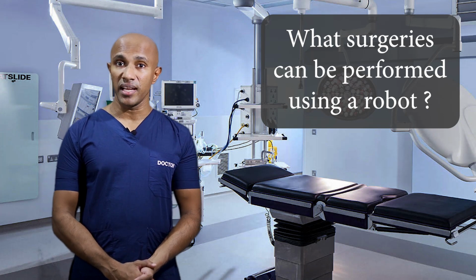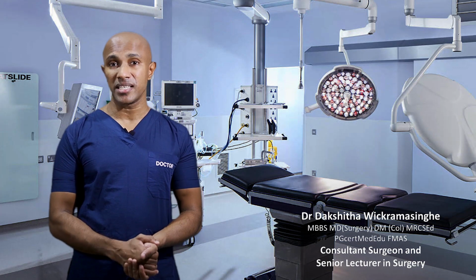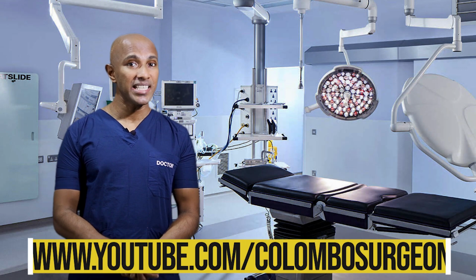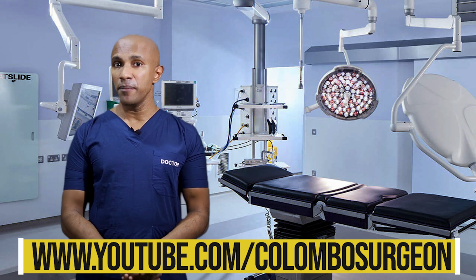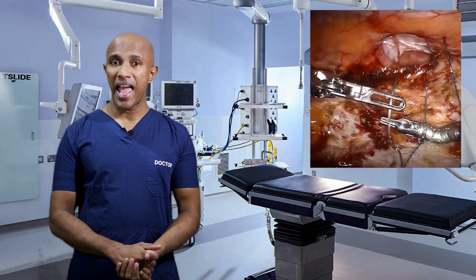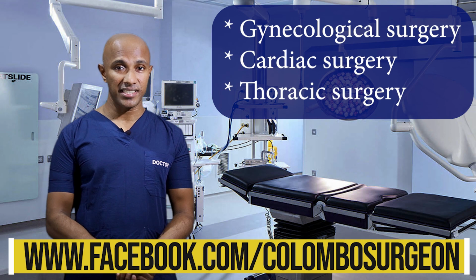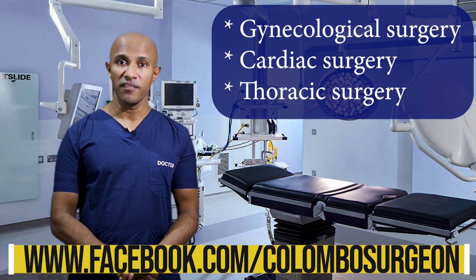Many types of surgery can be performed as robotic surgery. Any surgical procedure previously performed as open or laparoscopic surgery can be performed as robotic. In addition, certain procedures which could not be performed laparoscopically can be done via a robot. These include certain hernias and certain cancers in the pelvis. In addition, gynecological surgery, thoracic surgery, and cardiac surgery or heart surgery can also be performed with a robot.